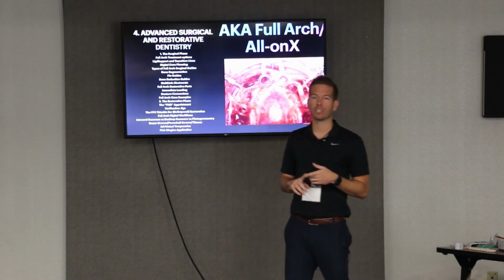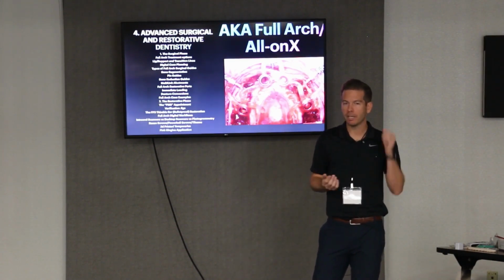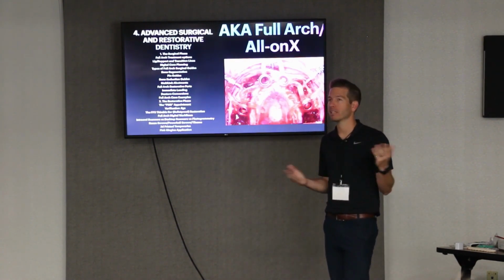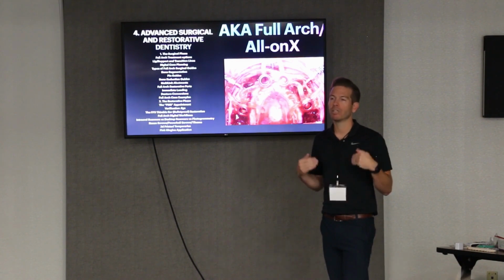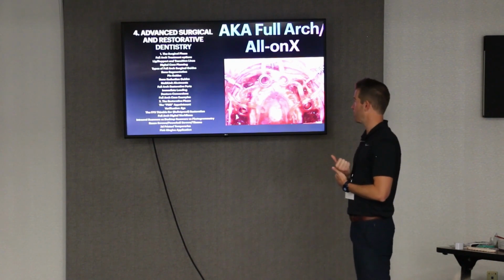I think that starting off, it's very, very predictable to think about not doing immediate loading, or alternatives to immediate loading. The most stressful part about full arch dentistry is immediate loading. And there's alternatives. We think about the sexy aspect of teeth in a day, but it doesn't always have to be done like that. How do we keep this predictable, comfortable, so that guys can jump in, do this stuff right away, and not be scared of the problems or the complications, which a lot of times revolve around immediate loading.